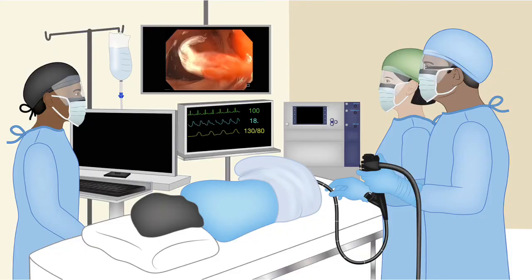So when it comes to setting up the scope, which scope should you go for in a patient who comes in with lower GI bleeding?